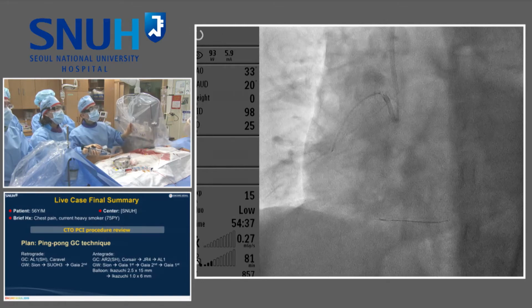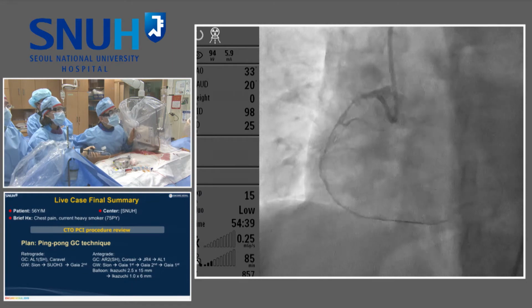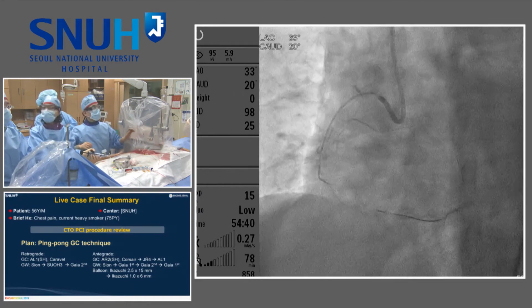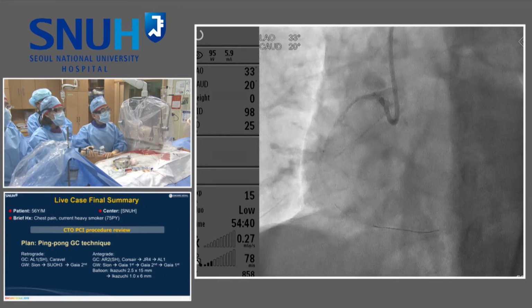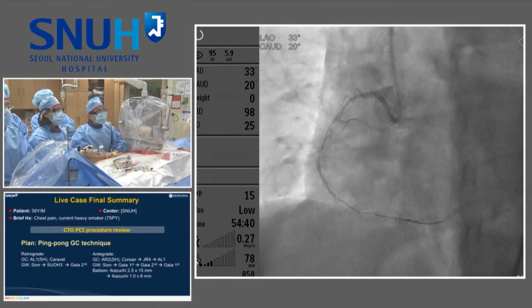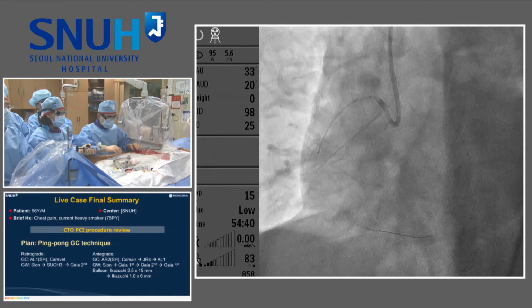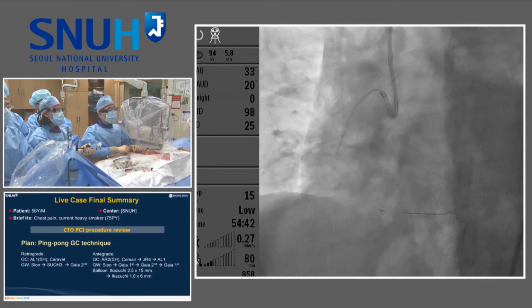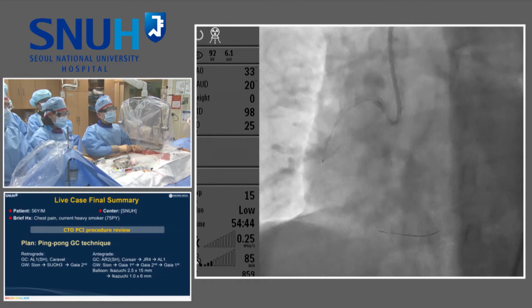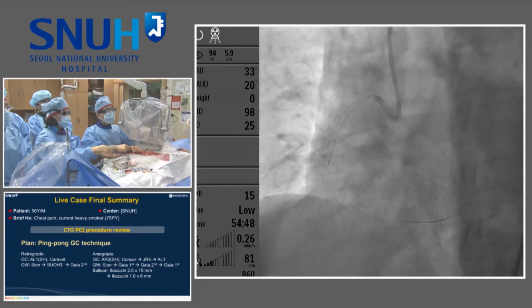자, 테스트 한번 볼까요? 30. What length of it? Do you want to fix it with just a single stent? No, I just want to put the first stent, then see the distal morphology and decide the second stent. Before stenting, I try to remove the retrograde microcatheter, as shown here.